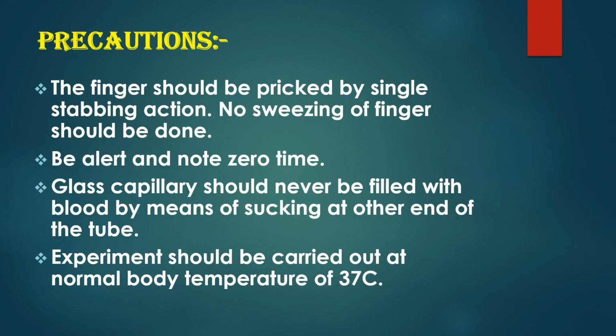What are the precautions that we should take while doing this practical? First, the finger should be pricked by a single stabbing action. No squeezing of the finger should be done. Second, be alert and note the 0 time. Third, the glass capillary should never be filled with blood by means of sucking at the other end of the tube. Okay. Fourth one, the experiment should be carried out at normal body temperature of 37 degree Celsius.